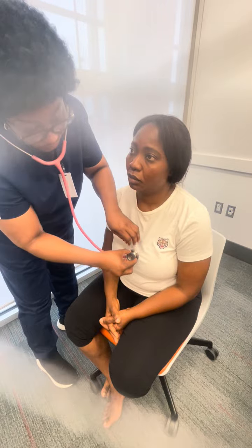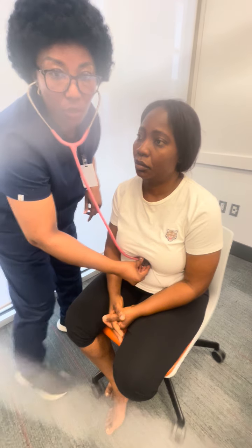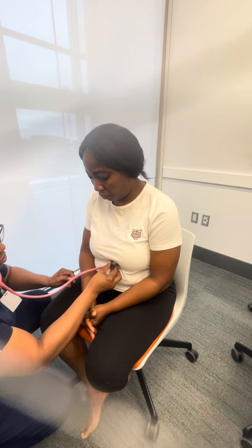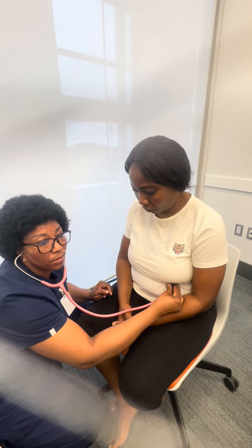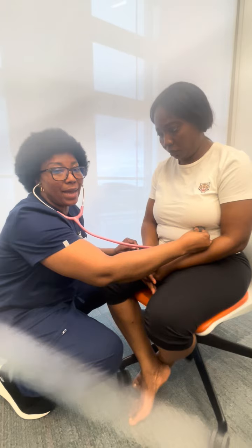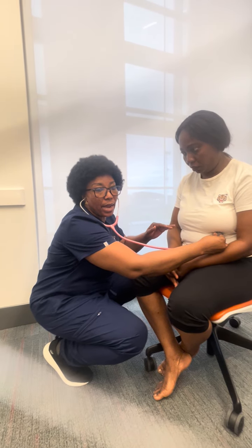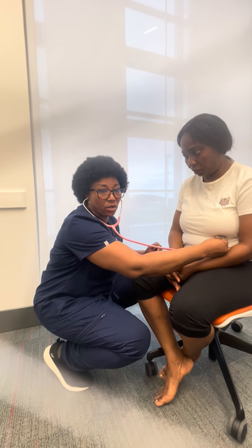Okay, now I'm going to move to the tricuspid, which is the fourth intercostal space. Now I'm going to move to the mitral, which is the fifth intercostal space. Okay, so S1 is loudest at the apex, and S2 is loudest at the base of the heart.